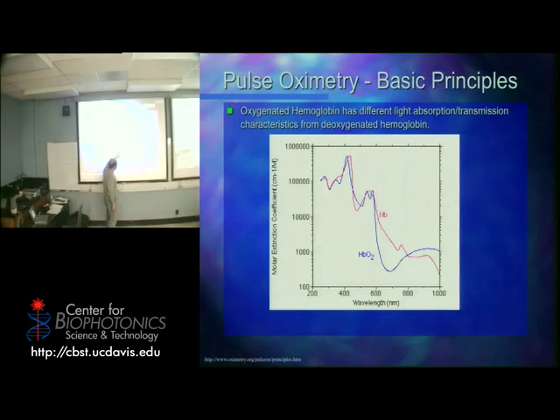And here it is. Oxygenated hemoglobin is absorbing less in the red than hemoglobin without oxygen. Okay? So the darker red means you've actually absorbed more of the red. The lighter red means you've absorbed less and reflected more of the red. So this makes sense with what we see visually. Brighter red, the hemoglobin with oxygen.